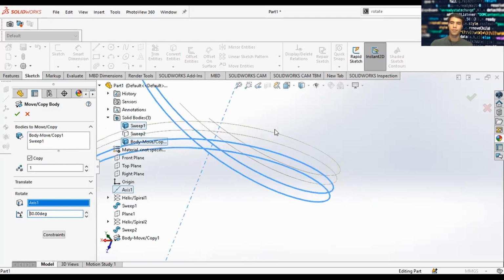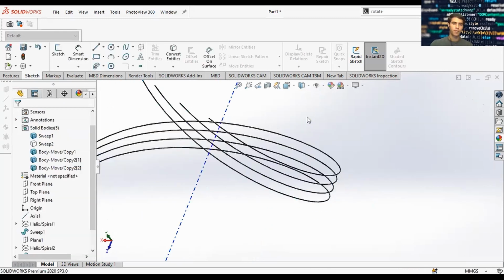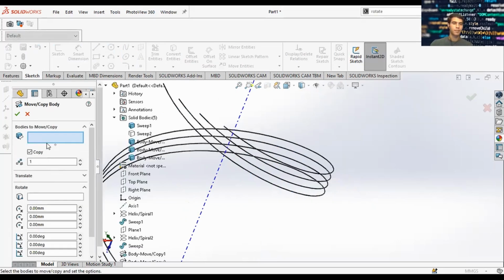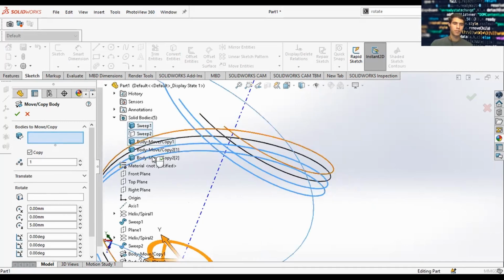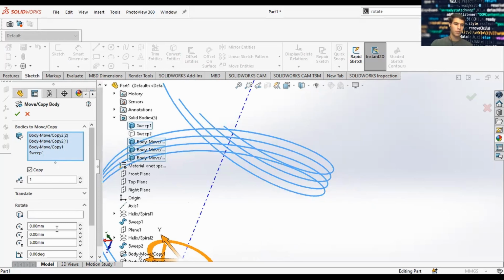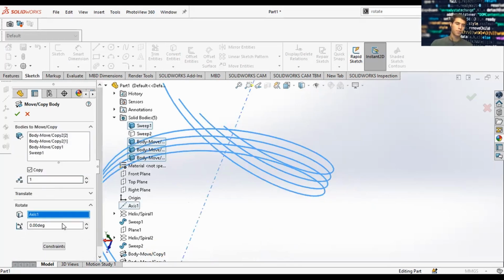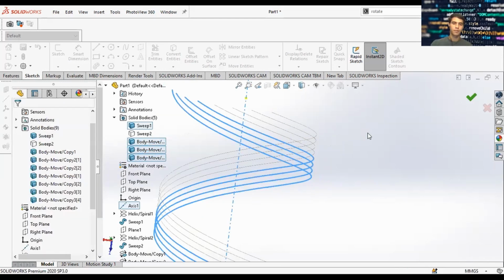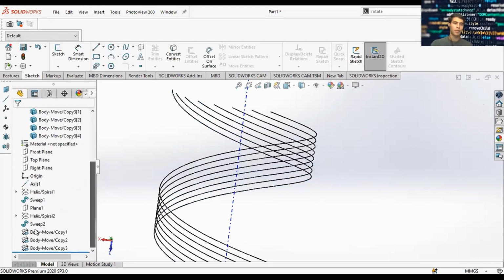Before and after. And now, just rinse and repeat. Rotate around our axis. And rotate 6 degrees. I'm getting there. And you can see with each feature we add, it shows up on our family tree.